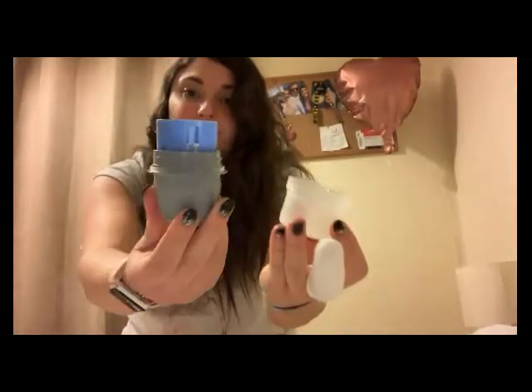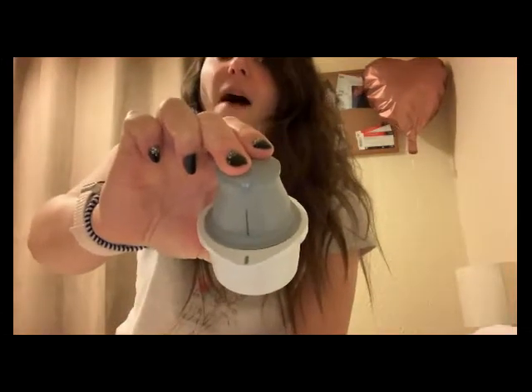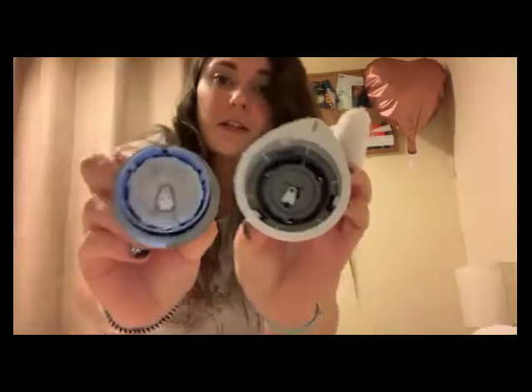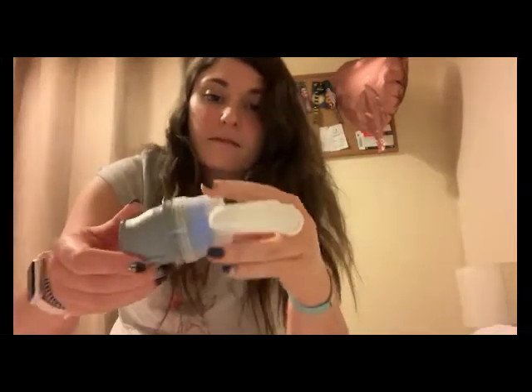Twist, then it's like that to start with. On there you see the black line, and the black line on there, you have to match them up, and then press, and that primes it, ready to insert. As you can see, the needle's in there ready. Then while I'm preparing the site, I just pop that in there temporarily.